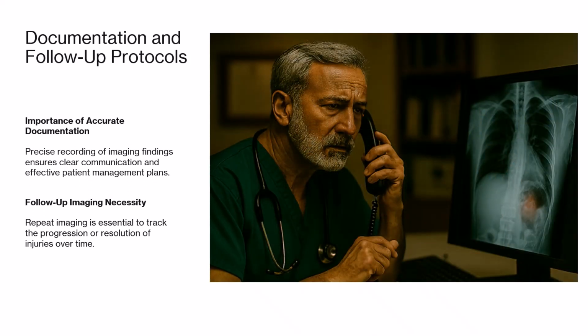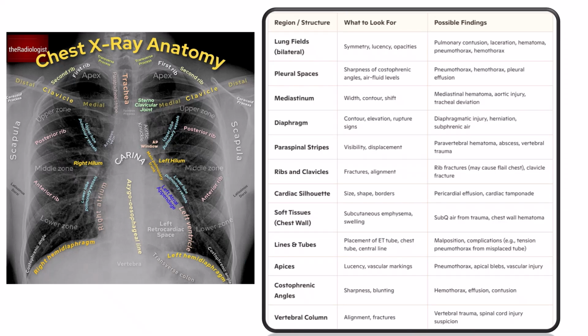Accurate documentation of imaging findings and subsequent management plans is vital. Follow-up imaging may be necessary to monitor progression or resolution of injuries. Here I put together a little table of the structure and the region of interest, what to look for, and possible findings. Take a few moments to take a look at each one of these.